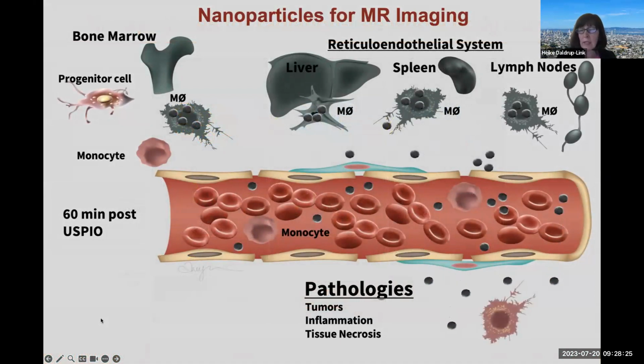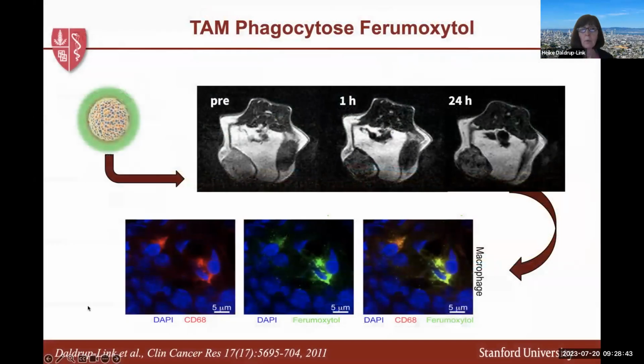So next, the nanoparticles leak into the interstitium of malignant tumors. And this is a slower process compared to the reticuloendothelial system. Here, the nanoparticles are also phagocytosed and retained by tumor-associated macrophages. We confirmed that some time ago by labeling nanoparticles with FITC, a green fluorescent dye. And we injected these nanoparticles into mice with implanted adenocarcinomas.